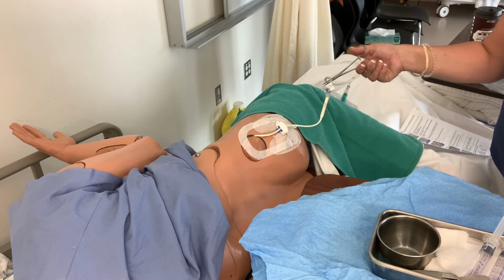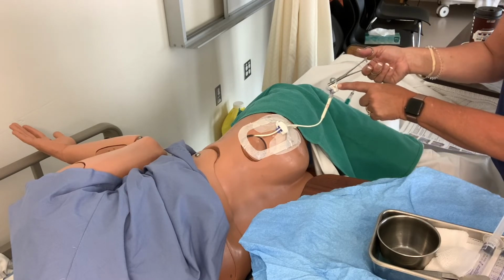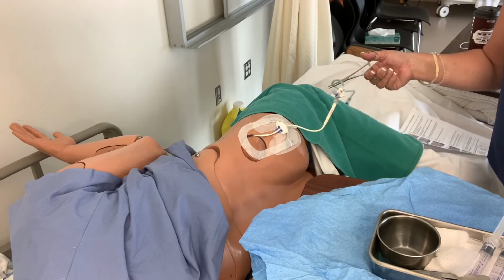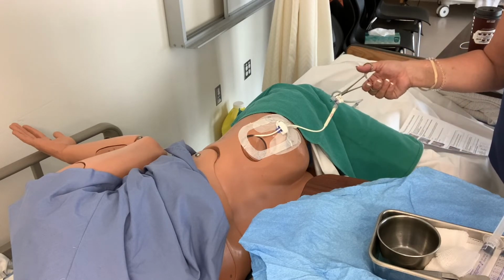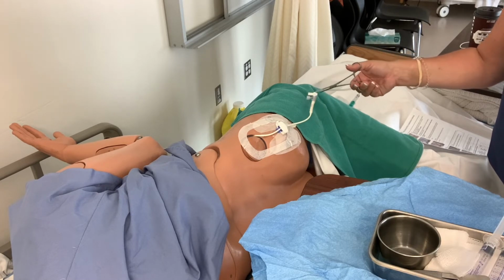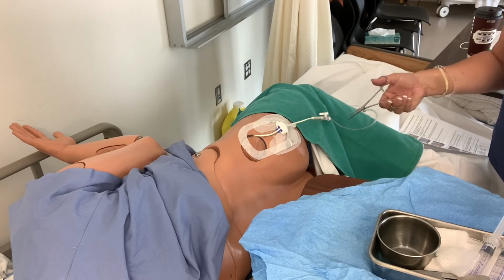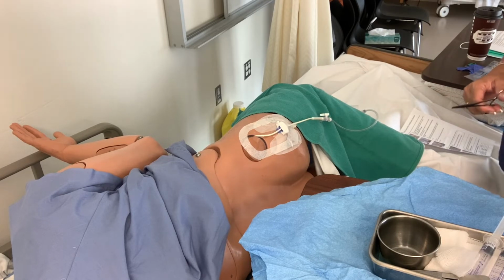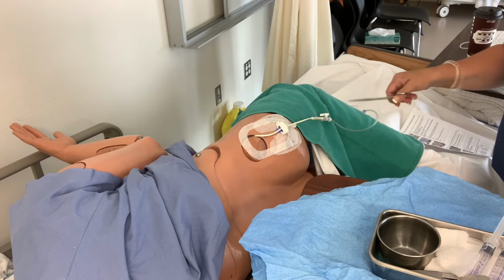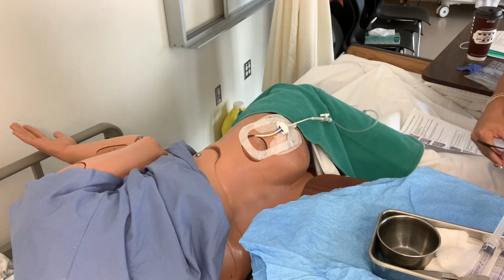But this little device here is called the stopcock, and I'll make a little section in the video where I can bring that a little bit closer so you can see it. And this is a three-way stopcock. So there's a little lever here that says off, and whatever direction it's pointing is off. So I'll talk my way through it, but then I'll show you a better visual at the end of the video. So I want to have that connection port on the sterile towel. I know a lot of times we never use a sterile towel, but this is the time that we're going to use it. So this is a sterile towel. I have that somewhat placed on there.